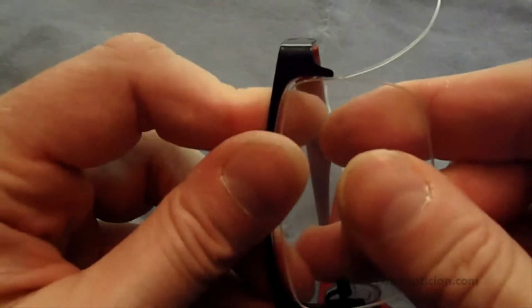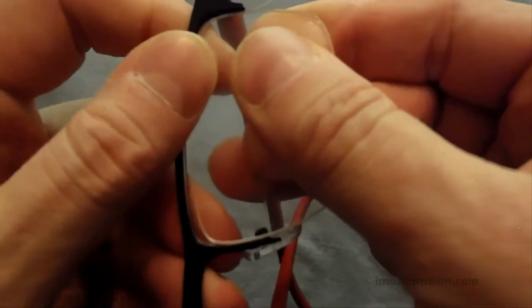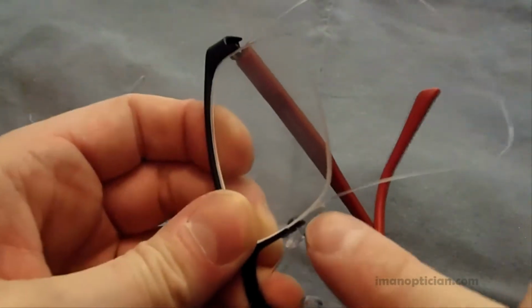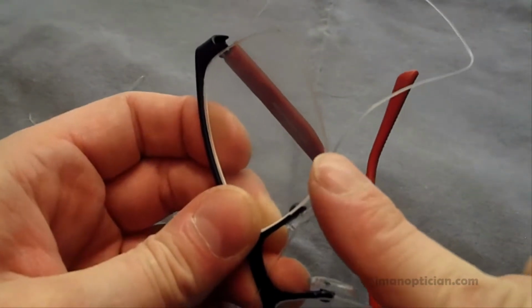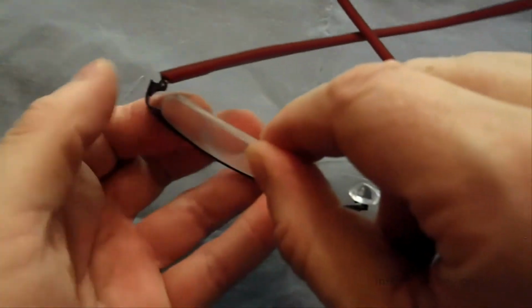Put your lens in. Make sure that that tag goes into the groove on your lens. Make sure the figure 8 liner fits in all the way around, and make sure that the eye wire is coming in here and there and fits into the groove of your lens all the way around like that.